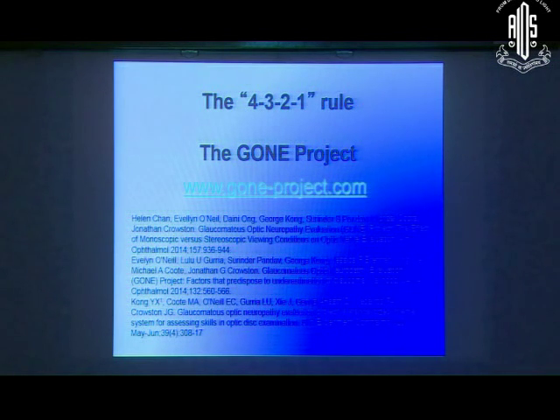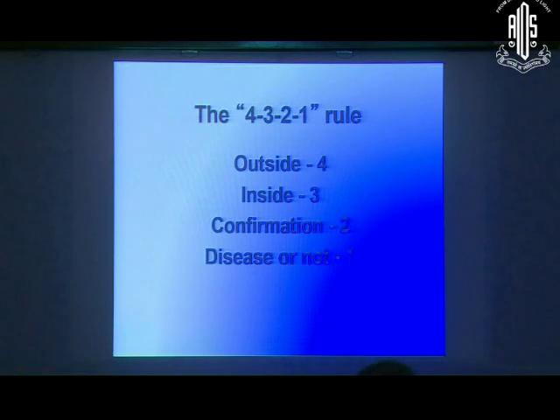Subsequently, we opened it up for the public, and 5,000 people have seen these discs and commented on them. And that data actually gave us very useful information on how people look at discs, what mistakes they make, what are the common mistakes, what are the reasons for underestimation and overestimation of glaucoma. And this data has been analyzed and published in some of the good impact factor journals already. So based on those experiences, we just came up with an arbitrary system, basically how do you look at the disc.